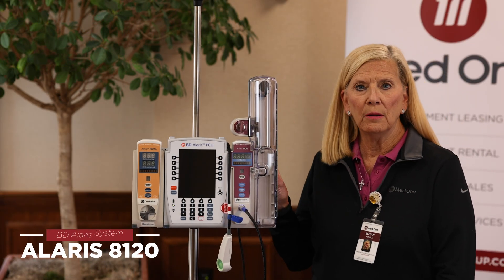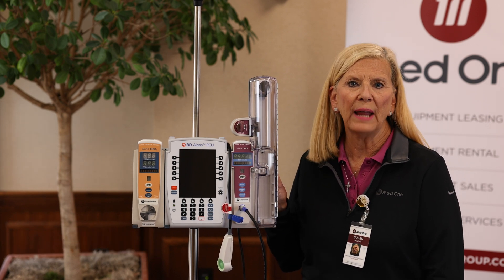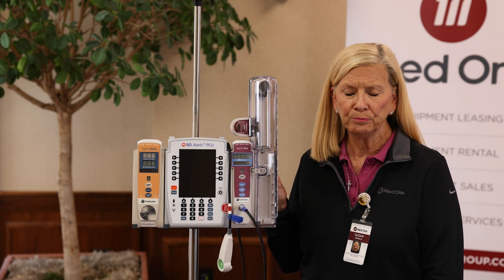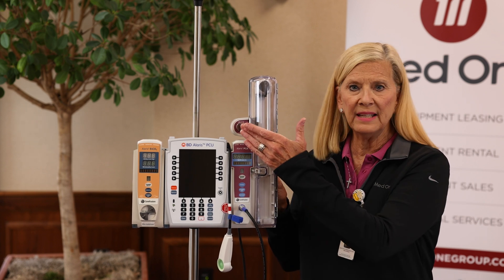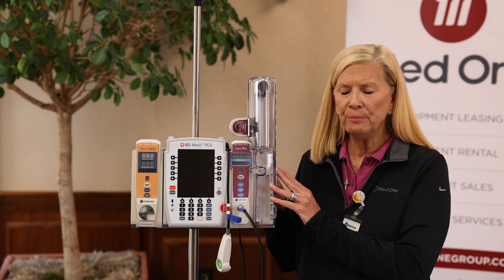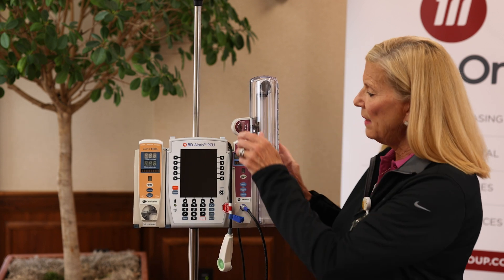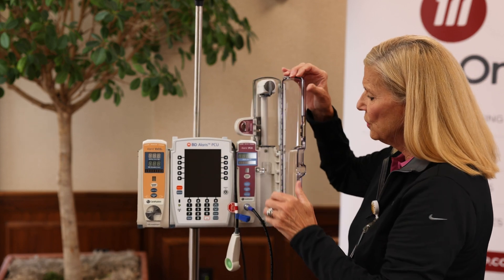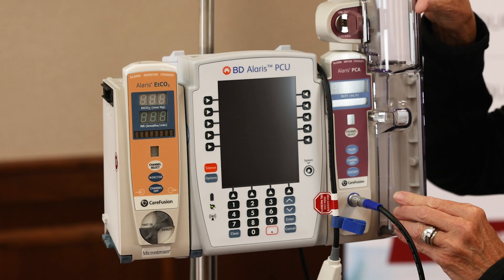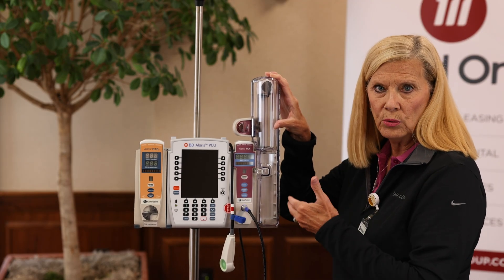The next module we're going to talk about is the PCA module, model 8120. PCA stands for patient controlled analgesia. This is usually used in post-op patients to control post-op pain. It is a syringe-based delivery, and you access to load it by a key. When you attach the PCA to the 8015, it must be on the right side of the brain — this is a safety feature. You need the key when opening the door to load your syringe, and you'll notice a latch here for how you remove and attach the module, so that a patient wouldn't just be able to take the PCA medications.